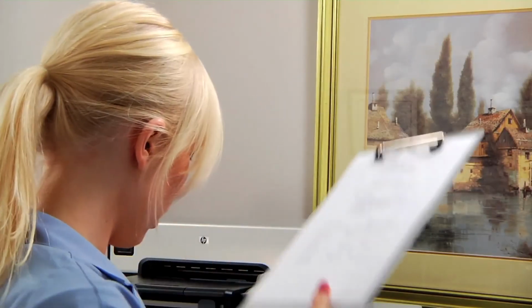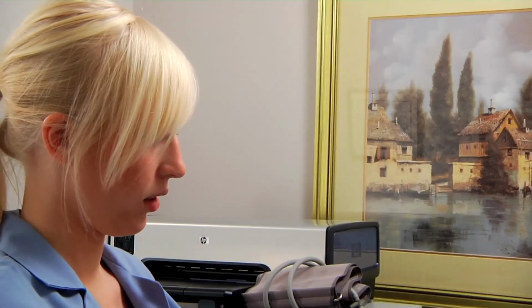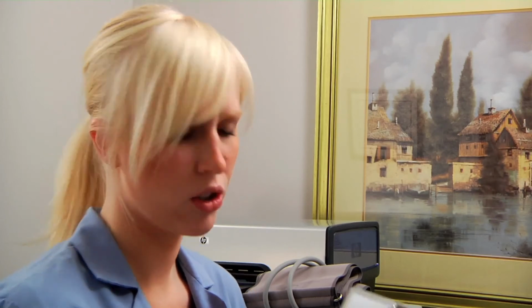I then look at my screen and I write down the blood pressure, systolic, diastolic, and the heart rate. I like to write it down right here on the testing sheet so that the doctor can see it briefly when he's just initially meeting the patient.